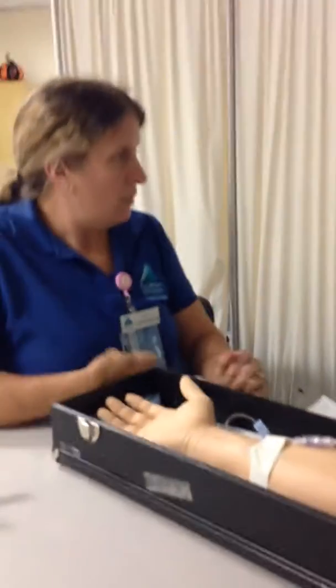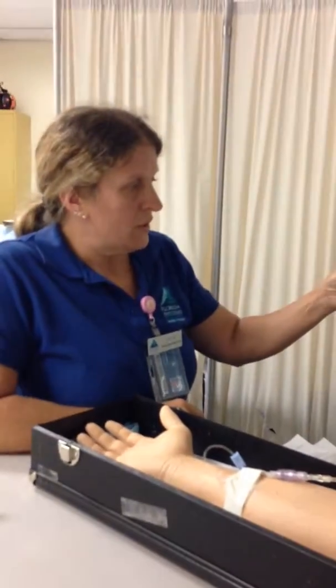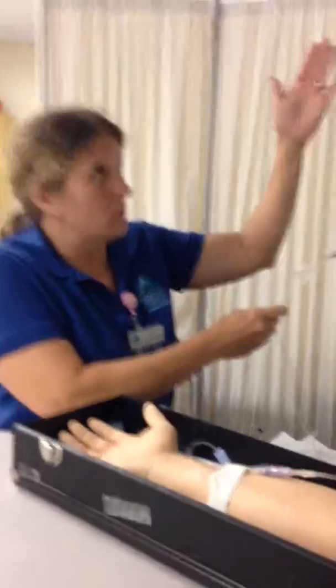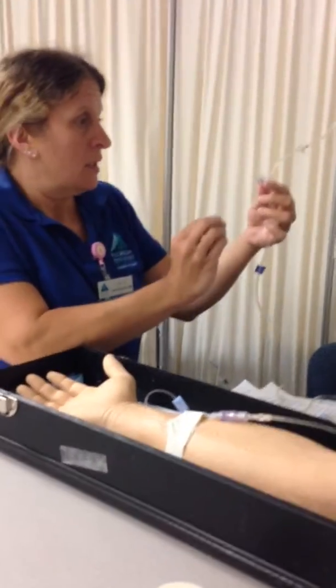I'm going to wash my hands and apply my gloves, and I'm going to use the first part, and the clamp is below it so that it will stop the normal saline, and it will start my antibiotic flowing. So I'm going to clamp this.